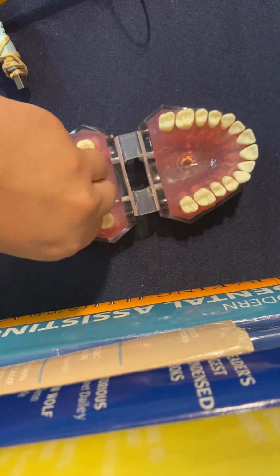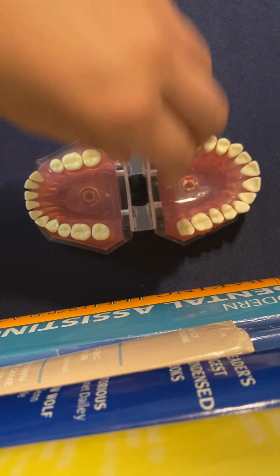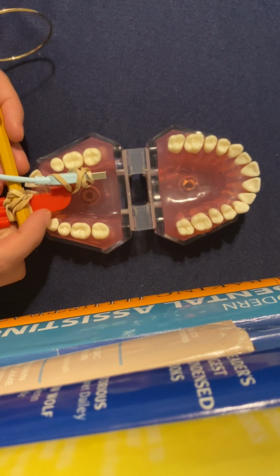Bitewings. All right, number 15. The right premolar bitewings. So you got this. I'm pretty sure, I hope I put this in there correctly. I did not.